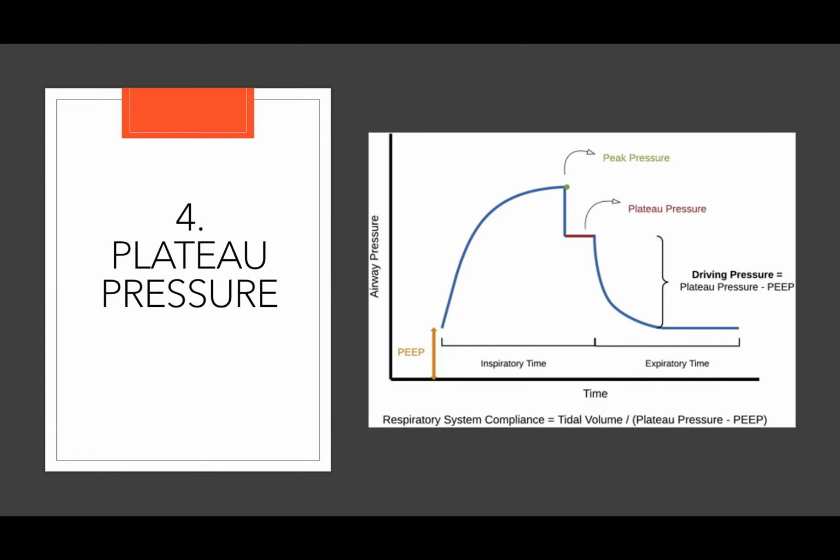Now, another point of discussion, which I don't think we know yet, is how can we accomplish that? So if we have PEEP, which we're using our PV tool, our transpulmonary pressure, it's telling us to set the PEEP at 22. It's going to be pretty hard to get even 4 mils per kilo in with just a driving pressure of 8. So I'd be curious people's thoughts. I think that what we've seen and what our understanding of the trauma of ARDS, that PEEP and optimal recruitment is important. So I wouldn't sacrifice PEEP. I would favor maintaining the driving pressure less than 15 and accepting a higher plateau pressure in that situation. So I'd be curious what other people think.